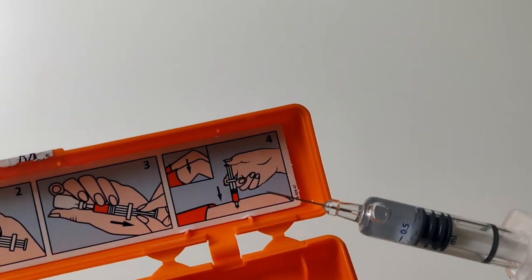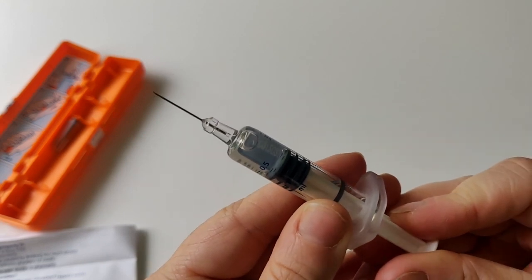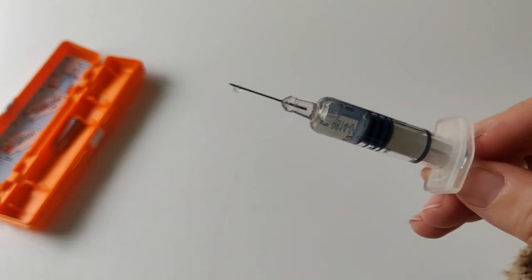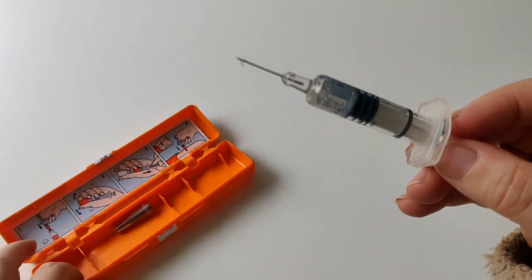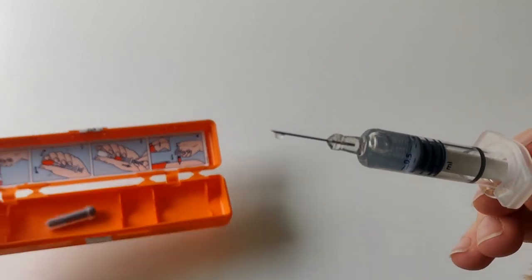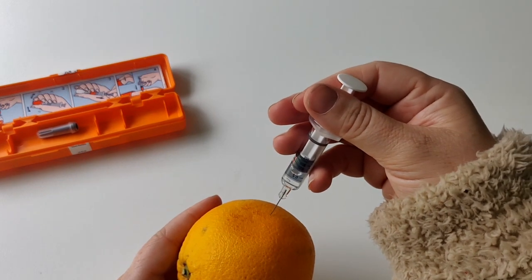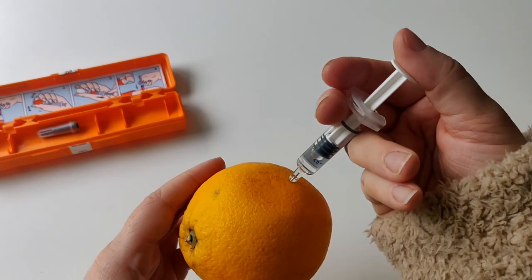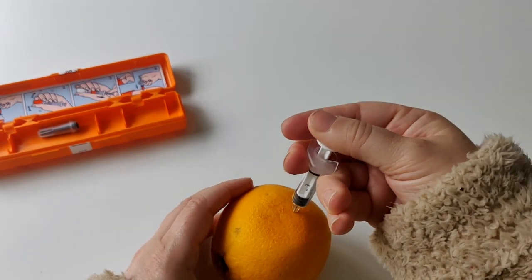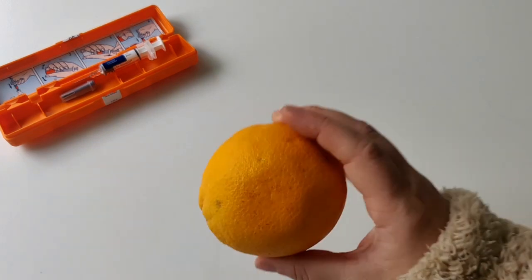Even though it is a panicky situation, take your time and follow the instructions carefully. Step four: make sure you have the correct dose — push a small amount of liquid out so some comes out, confirming it's ready. Inject the person in the leg or stomach — into skin or muscle. I'll practice on my orange now: get the injection in and push it all the way down until it's fully depressed, then remove it.